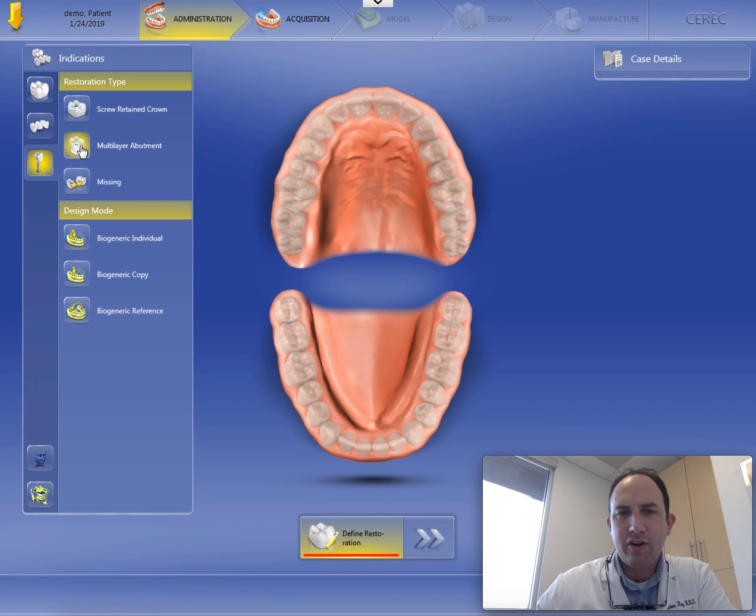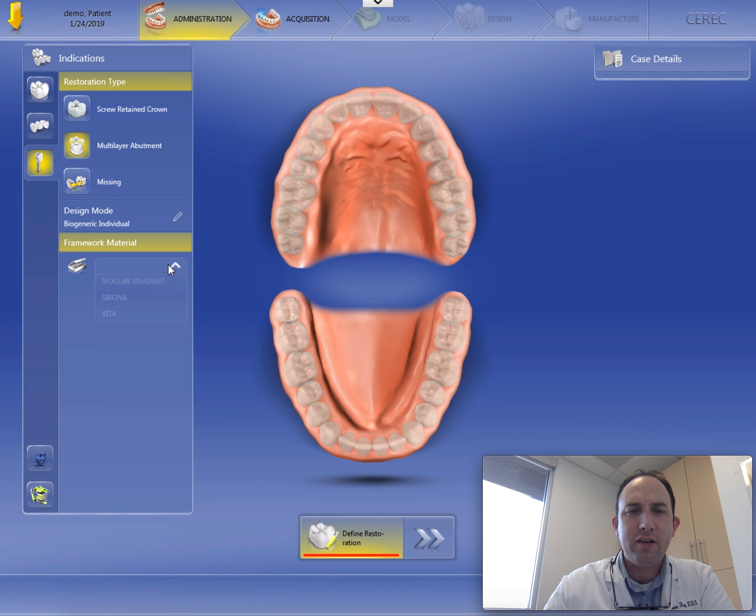It seems to be easier. You can certainly go back and forth and change them as your design is set up that way. But I usually set them up this way, and if I opt to split it later on in the process, that's fine. These are going to be bio-generic individual crowns. Now the framework material, I'm going to use emax, which is an Ivoclar product.